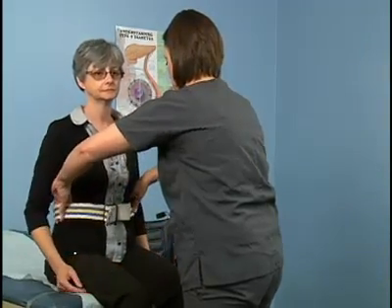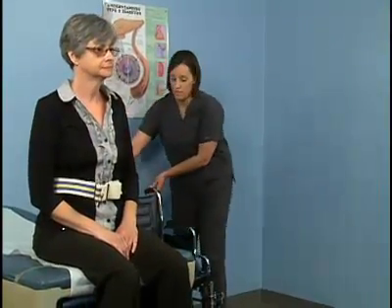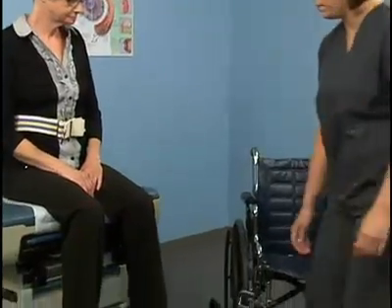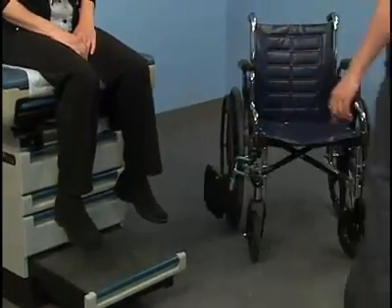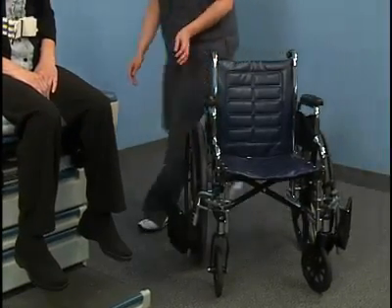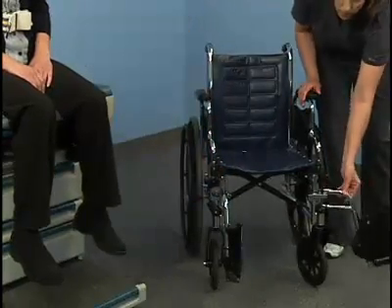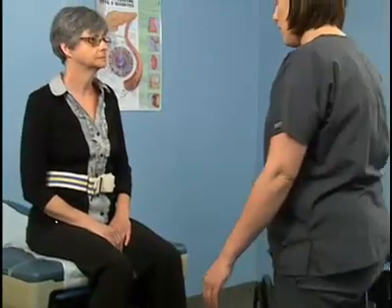Position the wheelchair at a 45-degree angle to the end of the examining table. If the table is height adjustable, adjust it to the same height as the wheelchair or slightly lower. If the table is not height adjustable, such as the one you see here, pull out the table's footrest. Lock the wheelchair and fold back the footrests if needed. Inform the patient about what to do during the transfer.